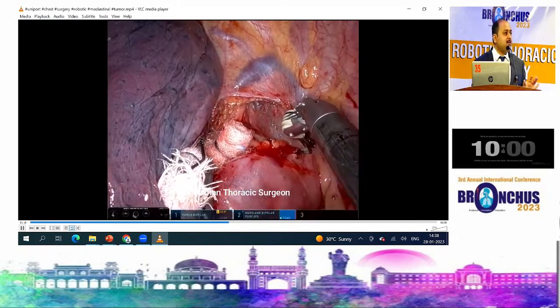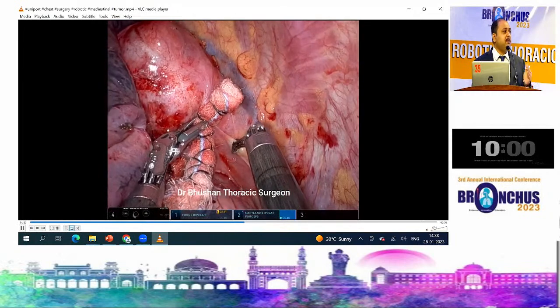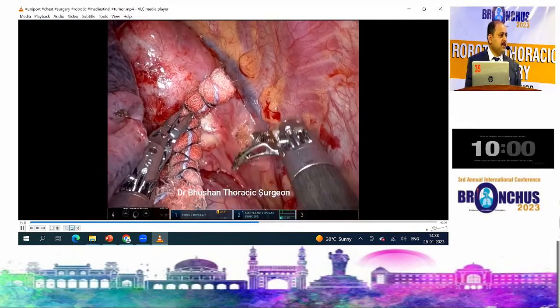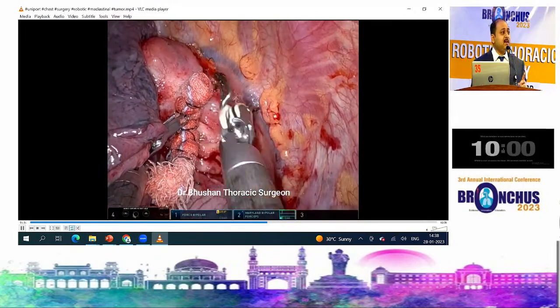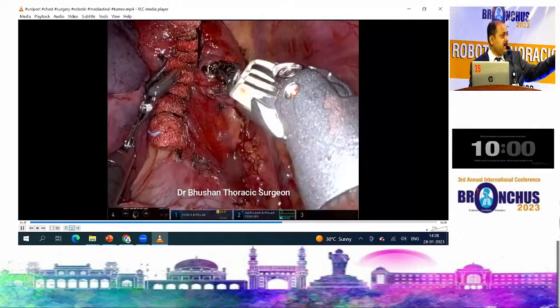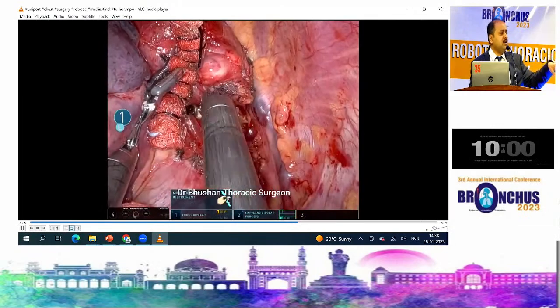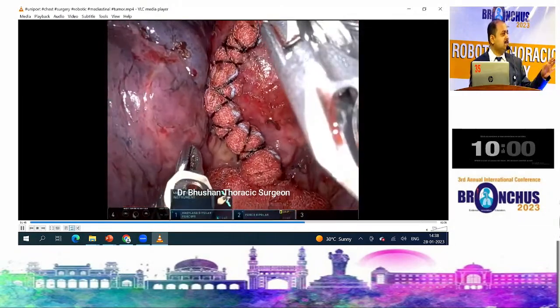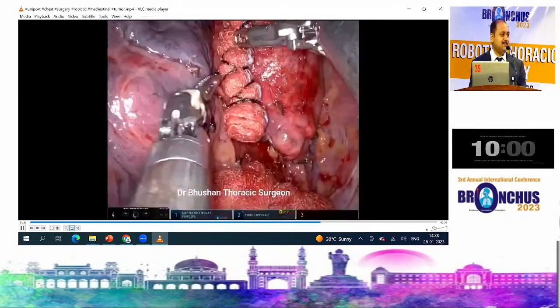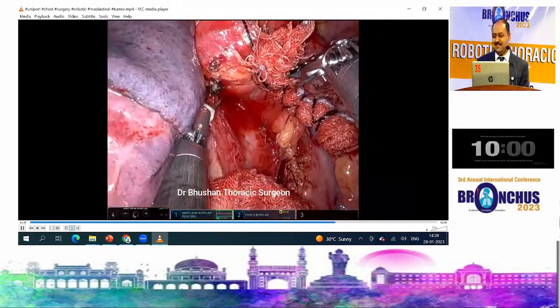And how much blood do you use? Generally, thymectomy is a clean-cut thymectomy. You don't require any transfusions. If it is a redo, or post radiotherapy or post chemotherapy, then definitely there is blood loss. And how much time? In the initial days, I took 3 or 4 hours. But with simpler cases, now this is a case where we removed one mediastinal tumor from the right side, uniportal robotic surgery. This was hardly around 2 hours, where the planes were very clean. An expert assistant is required, definitely. That saves a lot of time.